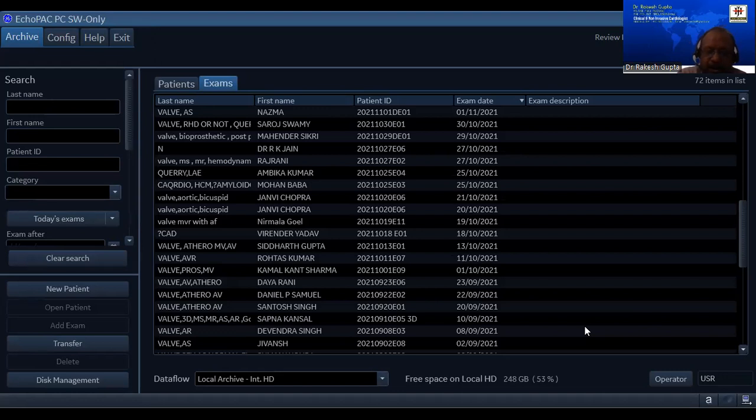Dr. Bhimrao Roop Singh Pawar, B.R. Pawar, are you there? Dr. Rakshit Bhardwaj. Dr. Pawar. Yes, sir. Tell me, how do you assess mitral regurgitation?